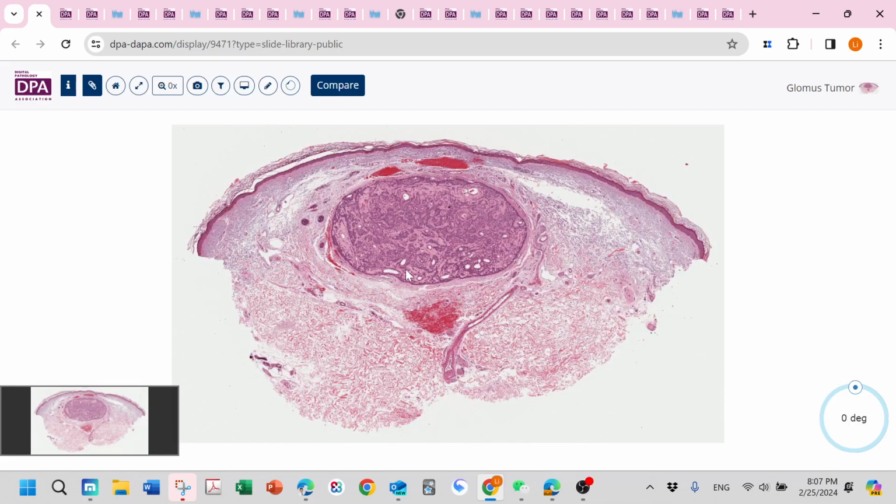When you cross the line here, left and right, it looks identical, relatively small. In this power, you may see some hyaline stroma, some empty space, really highly suspicious as a blood vessel.